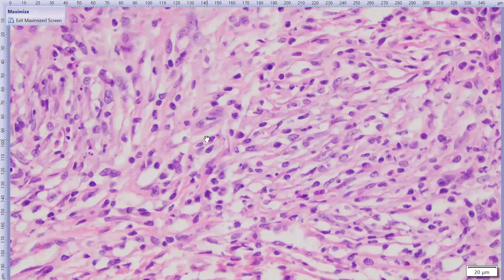And what we're missing, as far as trying to rule neoplasia out, although I've already told you that my interpretation at least is an inflammatory cell population, we don't have great cellular or nuclear atypia in any of these cells. We're also lacking mitotic activity. And the mixed cell population is good for a reactive cell population.